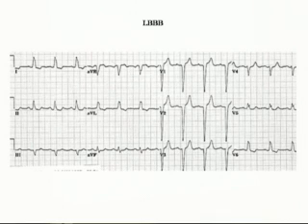When you see a left bundle, that means the left ventricle is not being activated normally. And all of our diagnoses we make, anatomic diagnoses and other types, depend on knowing how the ventricle is being activated. So when you see a left bundle, that's all you can say about the left ventricle. See left bundle branch block, you say, is there evidence of hypertrophy? Well, there might be, but you can't tell from the electrocardiogram. Is there prior myocardial infarction? Well, maybe so, but I can't tell from the EKG.